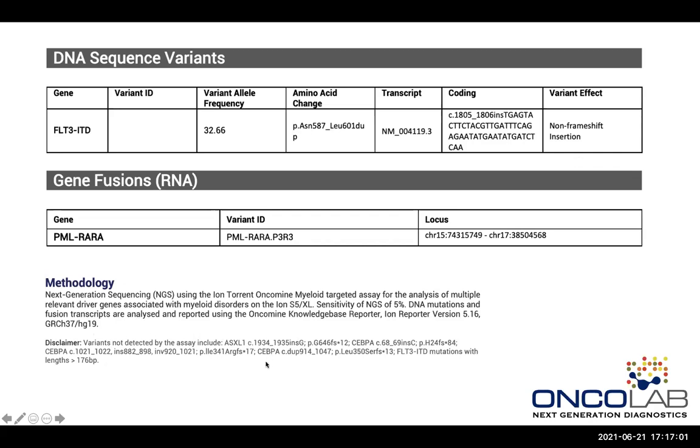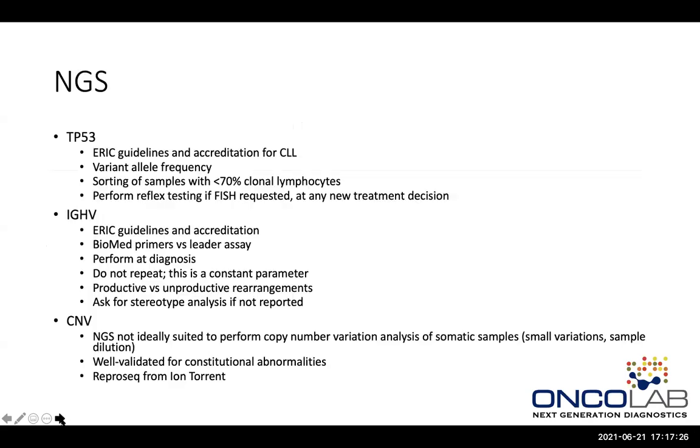What some labs overseas do, we don't do it at the moment, is that for these specific blacklisted genes, they will go and do a PCR with capillary electrophoresis to detect these. And certainly for FLT3 ITDs, that is preferable, because an NGS turnaround time of 2 weeks for a FLT3 ITD when you have a FLT3 inhibitor available is far too long.